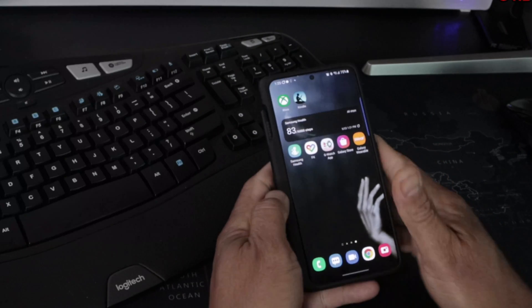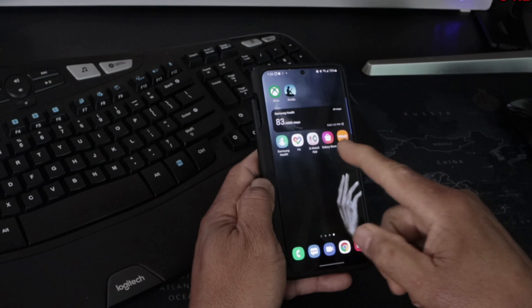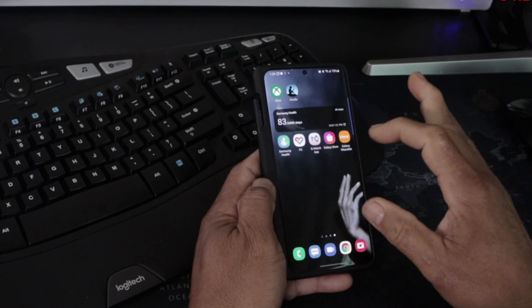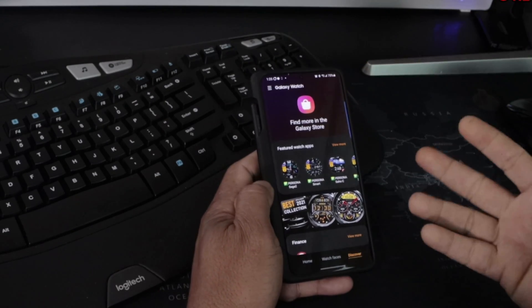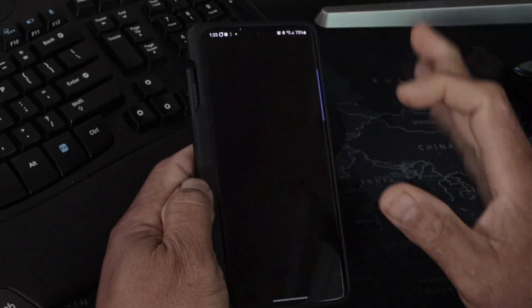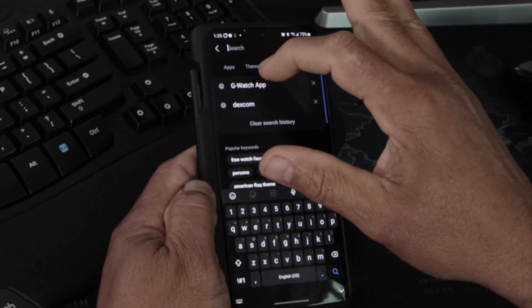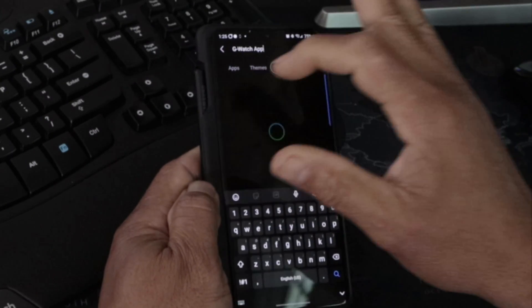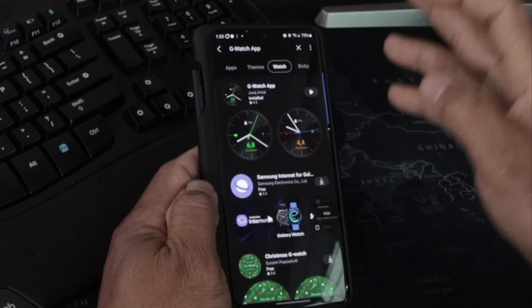The first thing you want to do is download the G Watch app onto your smartwatch. You can do it two ways: go to the Galaxy Store, or go to the Galaxy Wearable app right here. Make sure your watch is connected to your Wearable app, tap on that to open it up, and type in 'G Watch' to find the app.